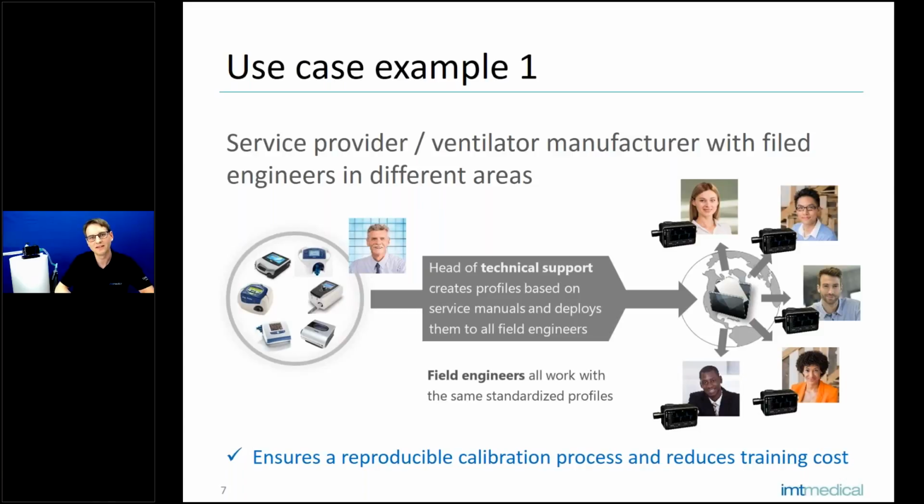Once he has created these profiles, he can deploy them to all his field engineers, making sure that they are all using the same profiles for their measurement tasks. So this ensures a reproducible calibration process and also helps minimize training costs, because all the engineers in the field can just load and use the same profiles.